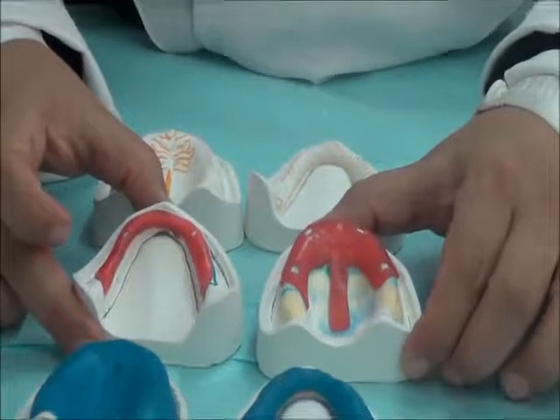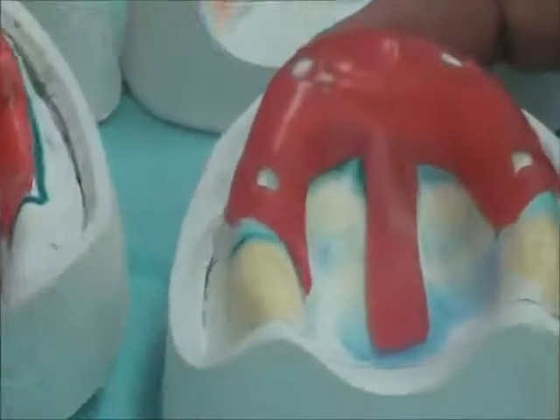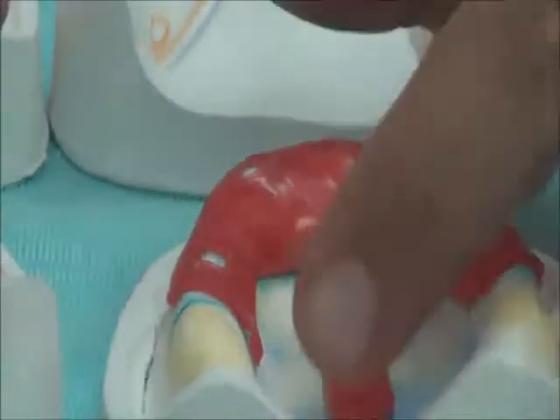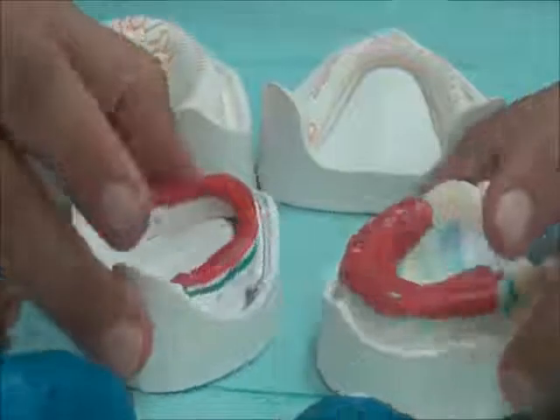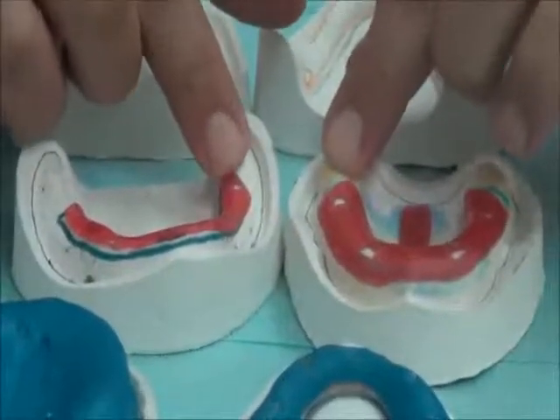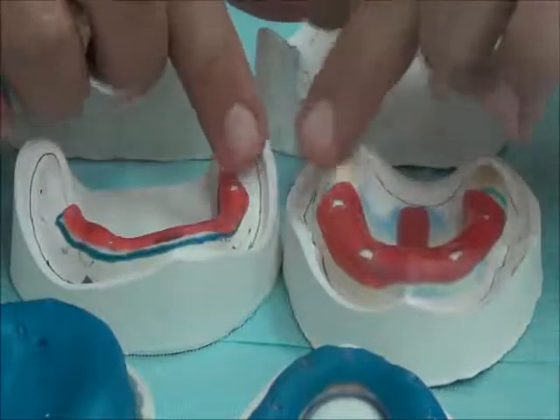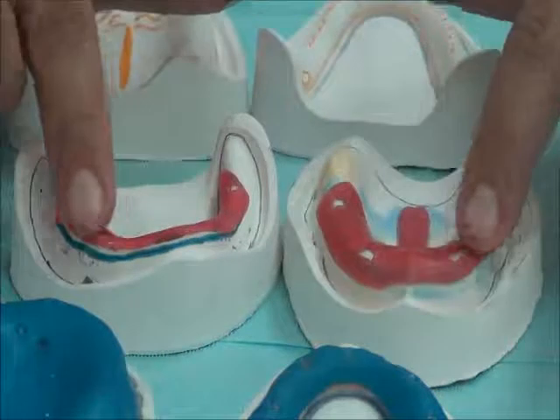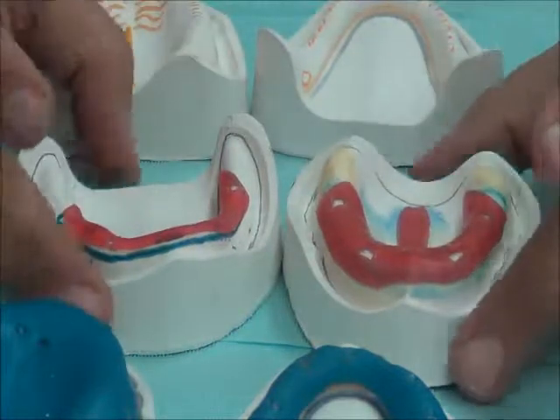And once I want to begin my impression, I remove the wax, and the impression material here will have sufficient space. While in the areas of support, the impression material will be closely and firmly pressed by the tray and the soft tissue, so these are compressed. While the areas where the wax was, it will be mucostatic, not mucocompressive.